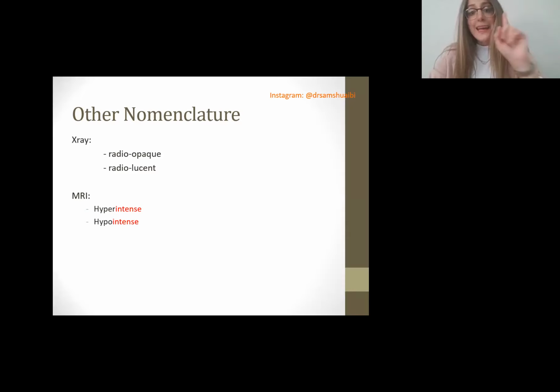When it comes to MRI, intensity, hyper and hypo intense. And with CT, it's density. Nobody will put it to you like this. I had to actually search it to put it in one slide. So always remember, density is with CTs. Always remember that, please. Okay, next.